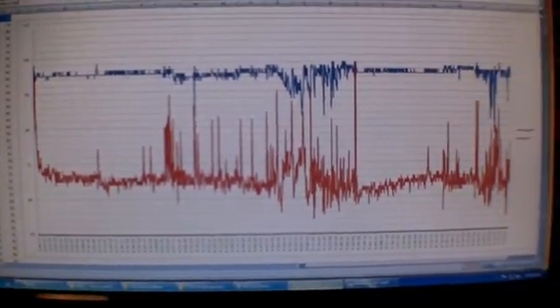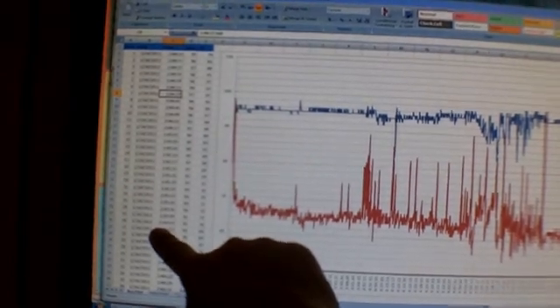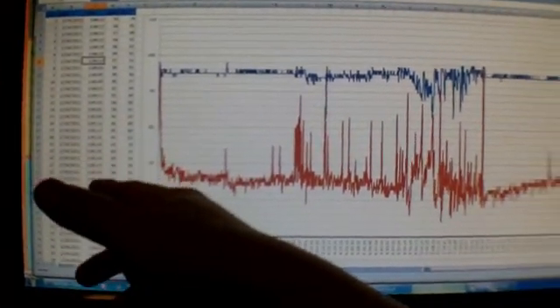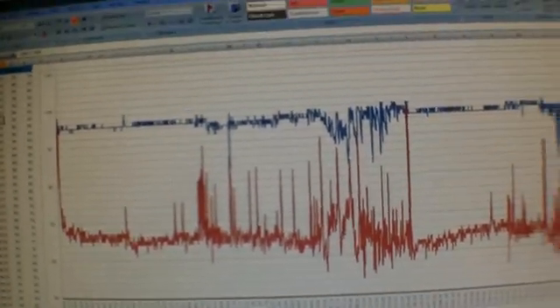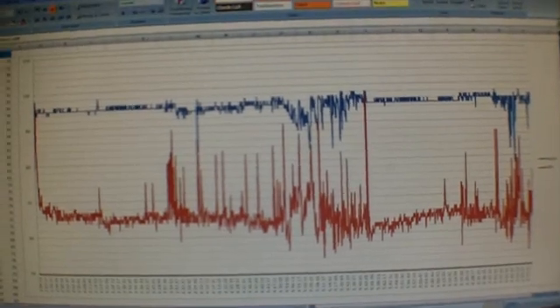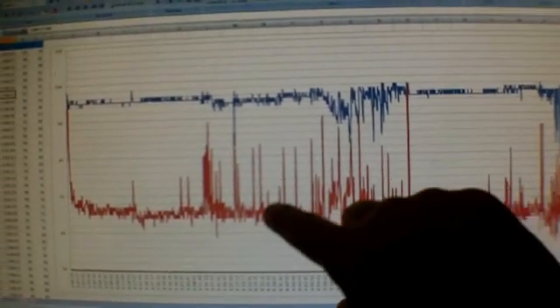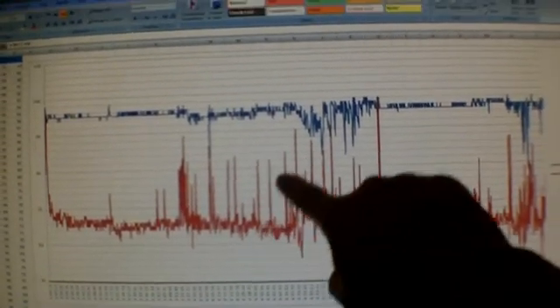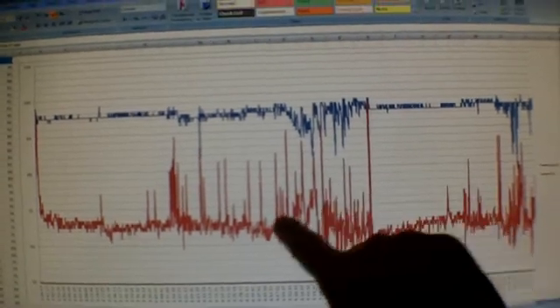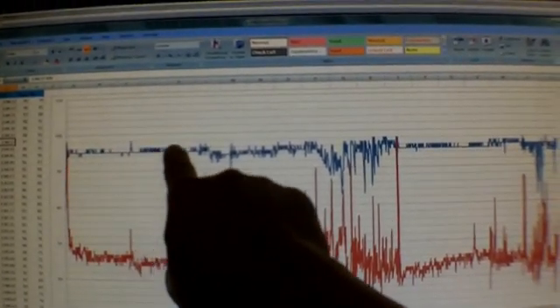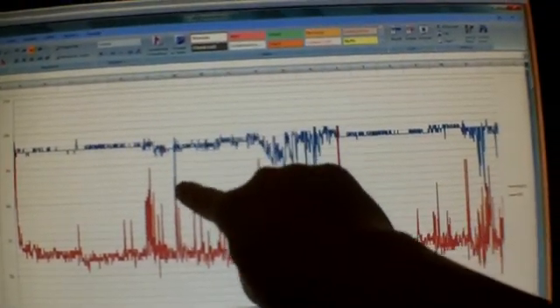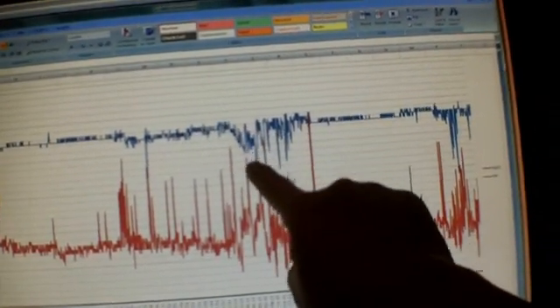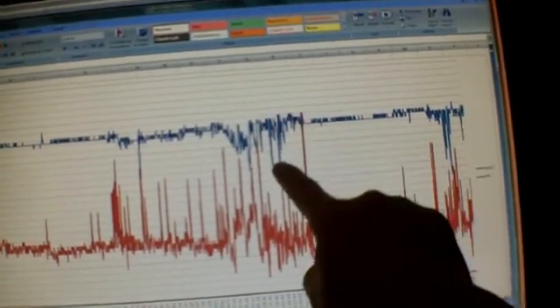Let me see if I can get a good shot of that graph there. So I have all the data for when I was not wearing my CPAP mask, which is a pressure mask. I have another video I'll upload later so you can see that if you'd like to. But what's important is this now easier to see chart where the data range is a little smaller so you can see the jumps. This is the oxygen level in my blood. It goes up a little, down a little, that's fine. But every once in a while there's like a huge drop, and really big drops.